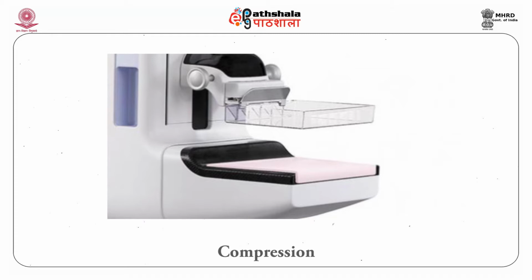What is the potential benefit of a compression device? It gives uniform breast thickness, reduces the blurring from patient motion, reduces scatter radiation and improves contrast sensitivity. It also reduces radiation dose. It also allows better visualization of tissues which are close to the chest wall.